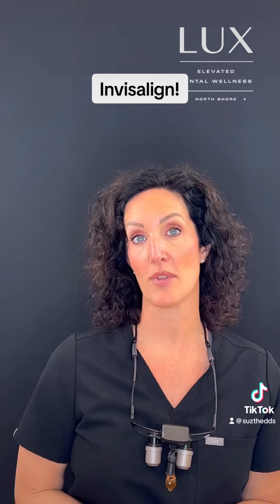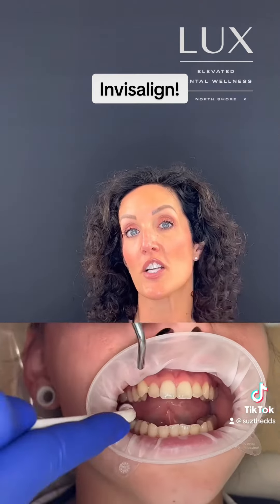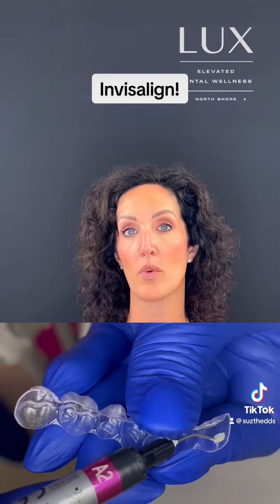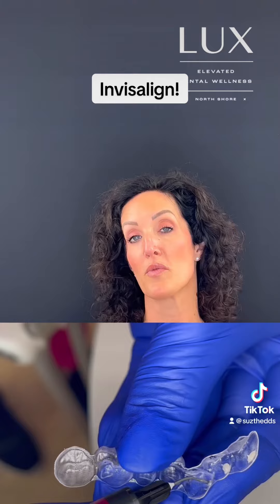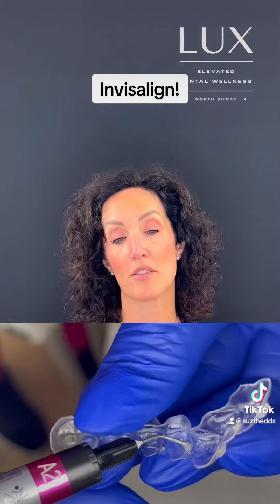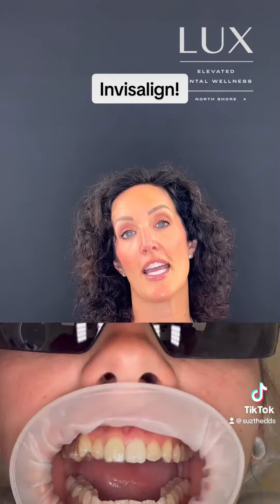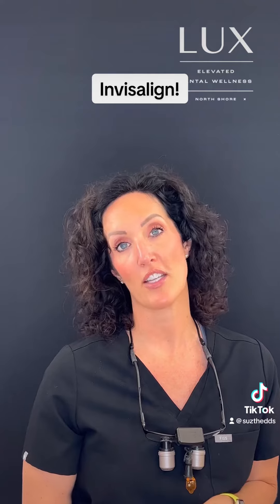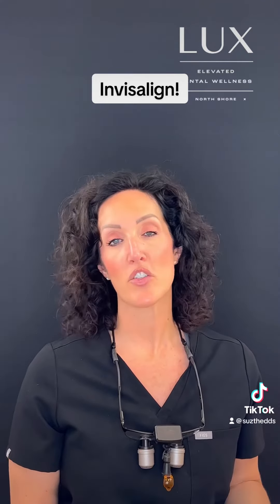The next step is to place the attachments onto your teeth. Attachments are small little resin bonded tags — they're tooth colored — that we place on your teeth where Invisalign directs us that the movements need to happen. The attachments are placed for the duration of the treatment, and most people don't love them but they do get used to them. They really are non-negotiable for Invisalign treatment at Lux, and they are super important.